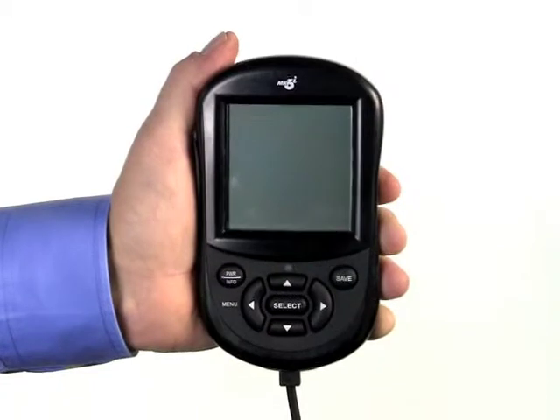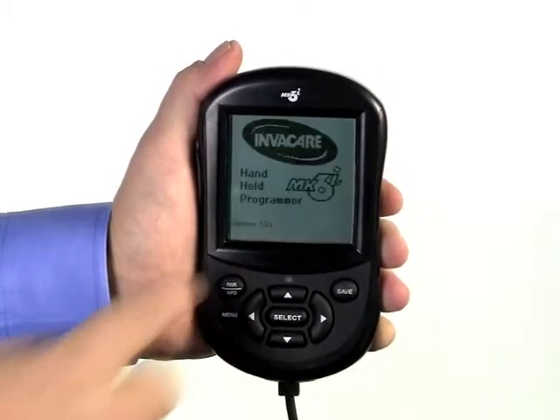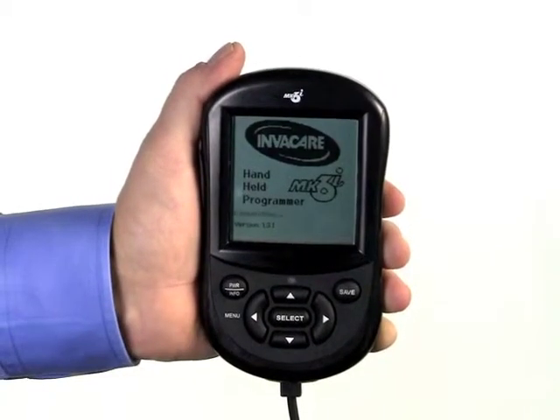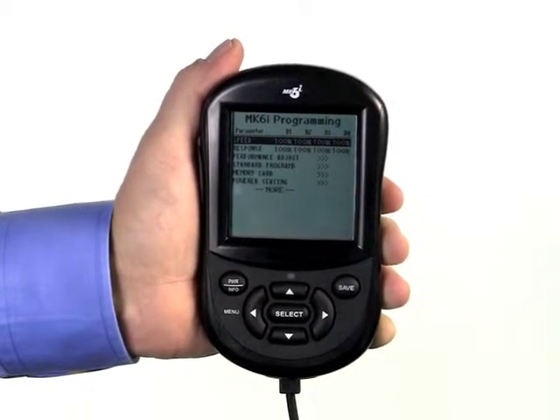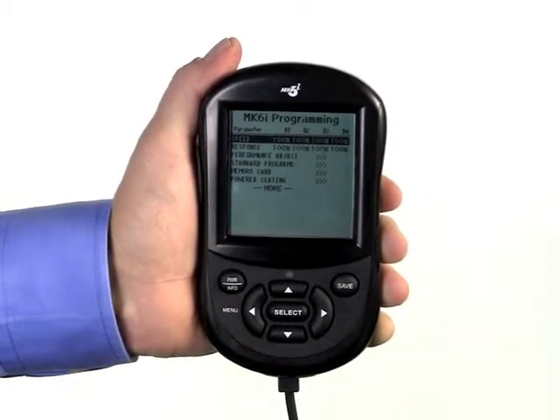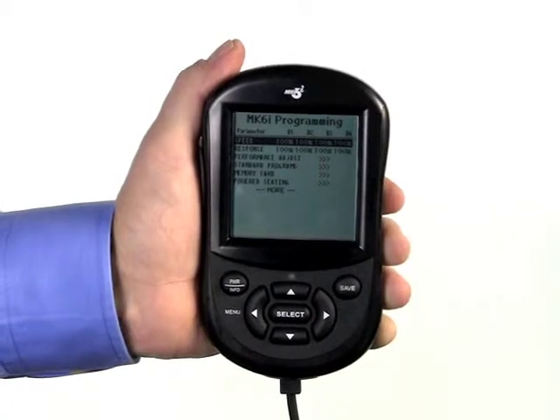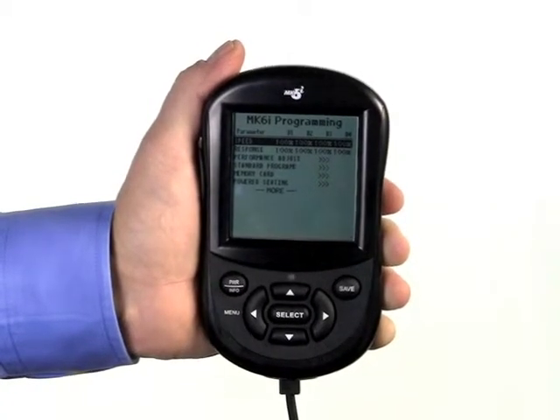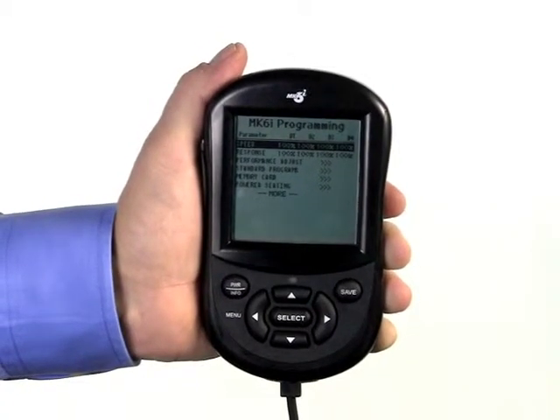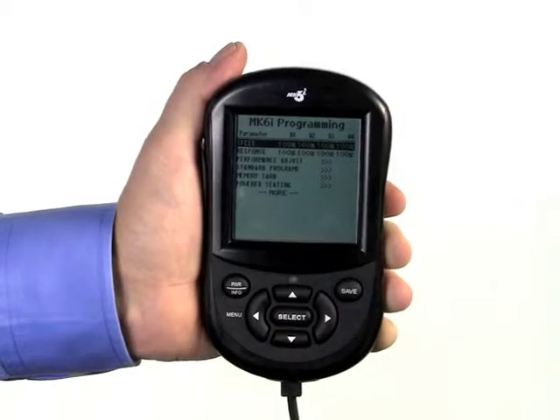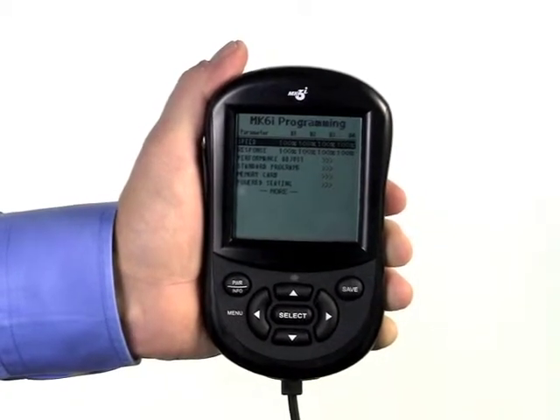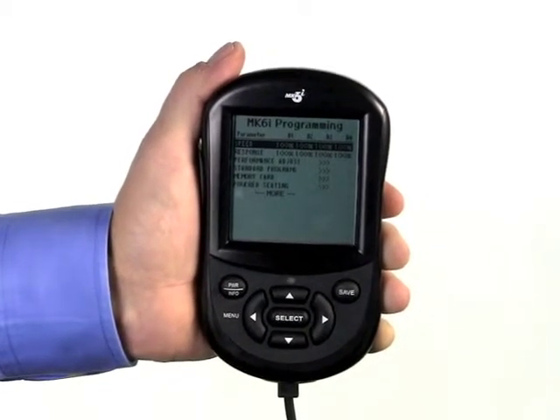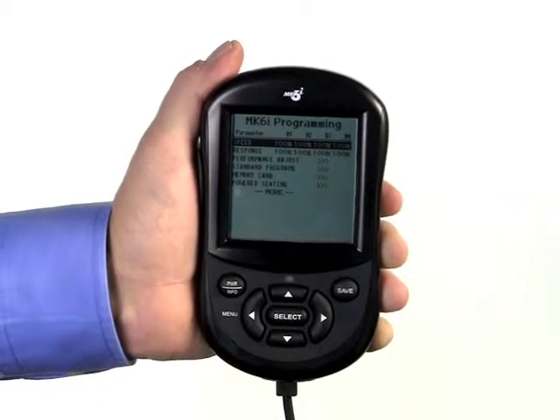This short video clip is intended to introduce you to the programming parameters of the Invacare Mark VI Electronics platform. Power chairs manufactured by Invacare are delivered with factory preset driving profiles that are intended to be a great starting point for many. Oftentimes, it is necessary to reprogram the chair to adjust the driving parameters to match the abilities and needs of the chair to the specific environments the user will be going.